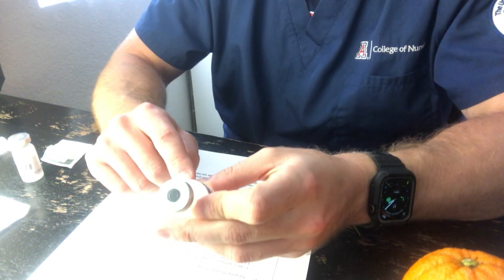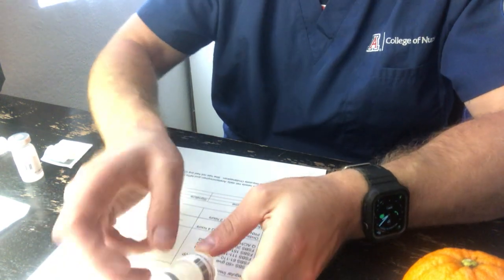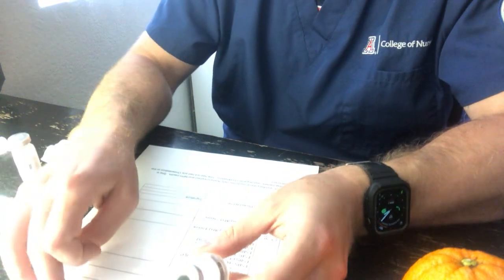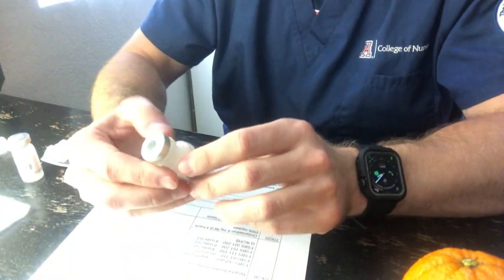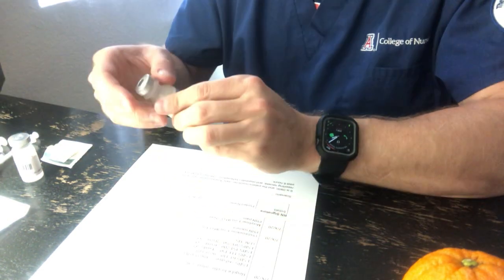The vial states it has 2 milligrams per mL. And I need to give 4, which means I'll have to give an equivalent of 2 mLs. So I have the right patient, I have the right drug, I have the right dose. I will have my insulin needle as well. It's the appropriate time and the appropriate route. I'll put that to the side. I have one more. Oh no, that's all 3. Okay, so I'm done with my first check.